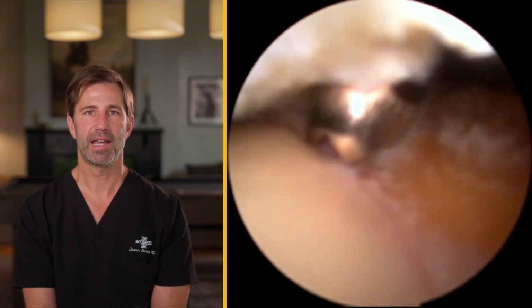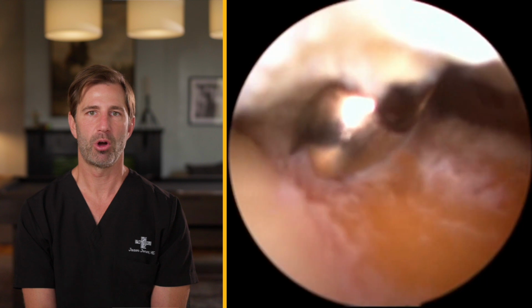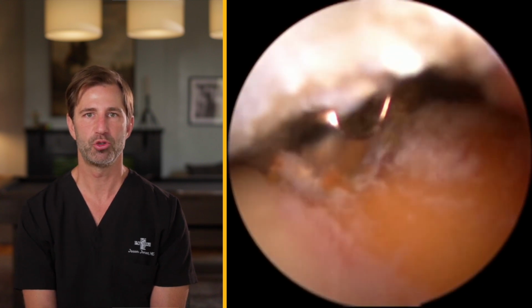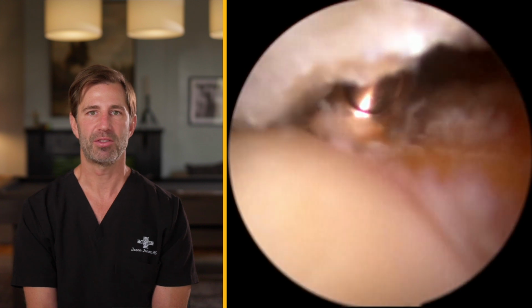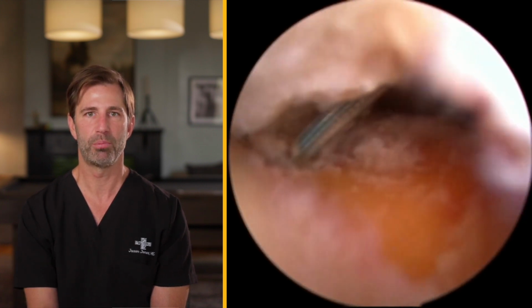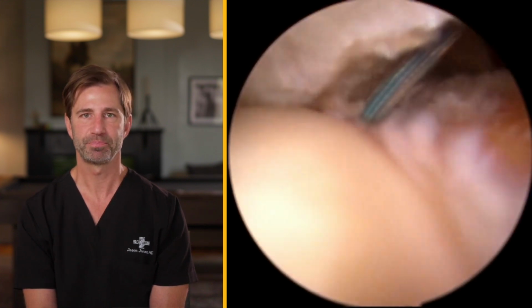The next portion of this case is we're drilling forward and inserting 2 anchors. Anchors are small screw type structures, although I now use anchors that are fully composed of suture material. What this means is that they're soft type of structures, and if for some reason they did come loose due to poor bone quality, it doesn't do significant damage to the joint itself.